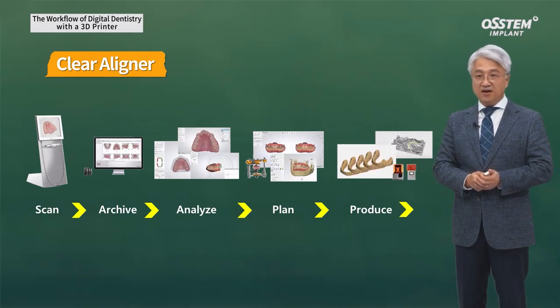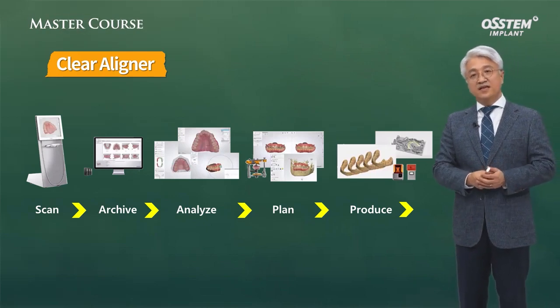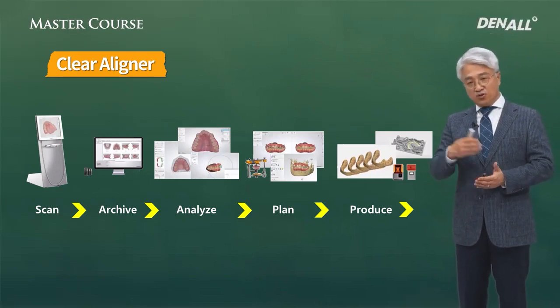In the orthodontic field, by using 3D digital dentistry, another major solution that we can use is a clear aligner.